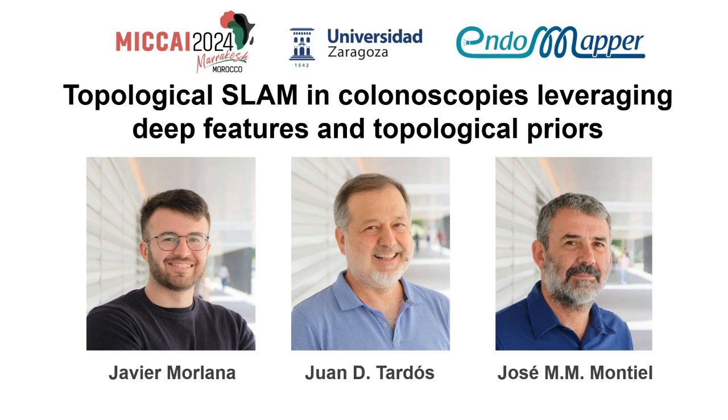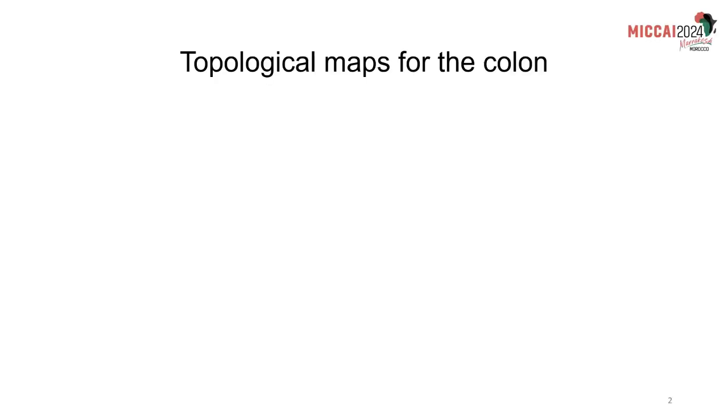Hi everyone, my name is Javier Morlana and I'm going to present my work, Topological SLAM in colonoscopies leveraging deep features and topological priors, a work developed with the help of my colleagues from the University of Zaragoza. Our work is about building topological maps for the colon.